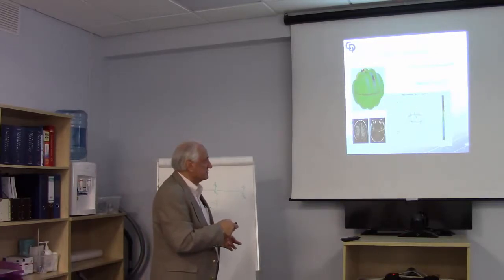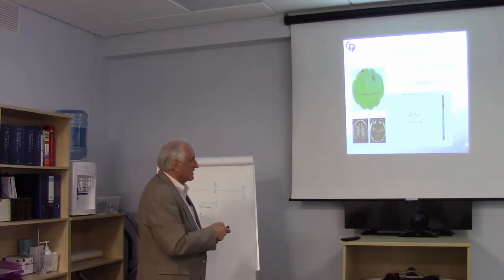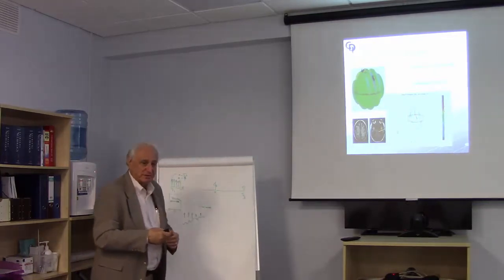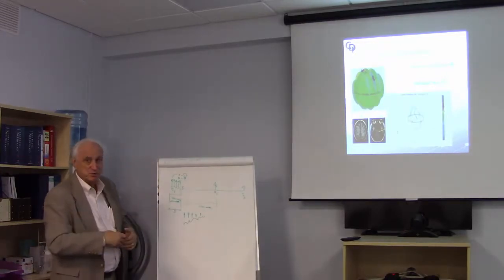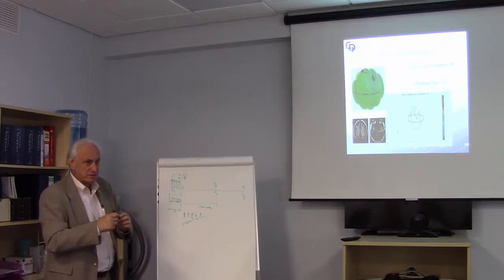These are where the stimulating electrodes were. They were not in the area directly where motor cortex is. Rather, they were down on the corticospinal tract itself, in those projections.